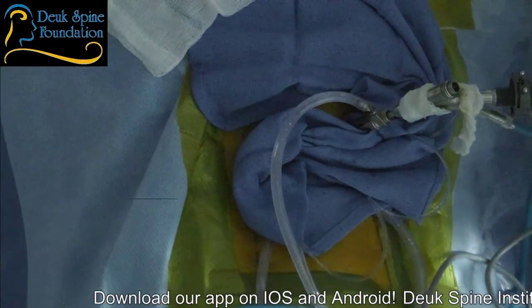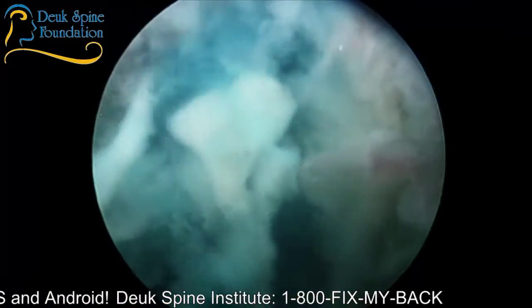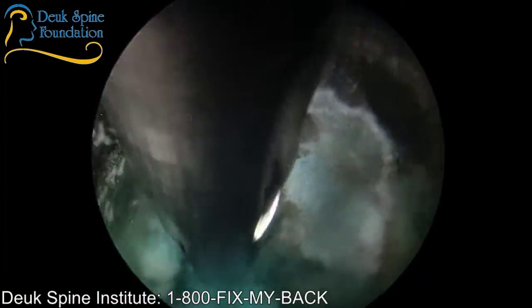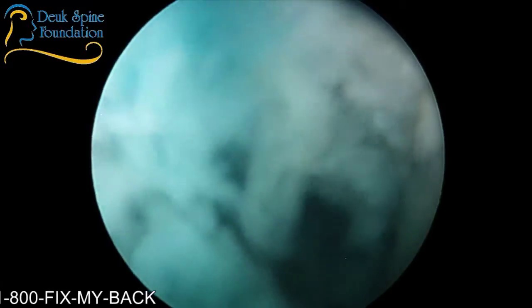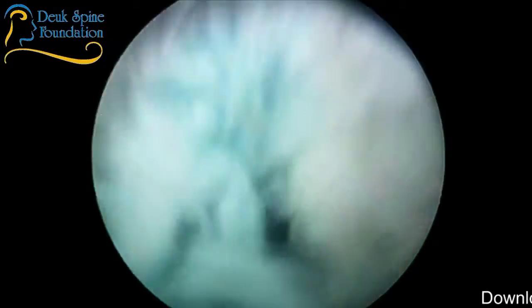All right, let's get everything on. I need the scope on, camera on. And it's December, what? December 10th. I'm horrible with names and dates. December 10th, 2019. So if you're watching this surgery today at 9:23 Eastern Standard Time, you're watching it live.